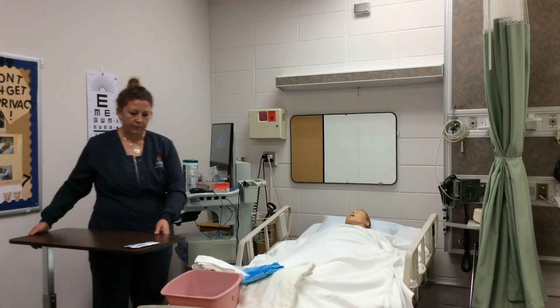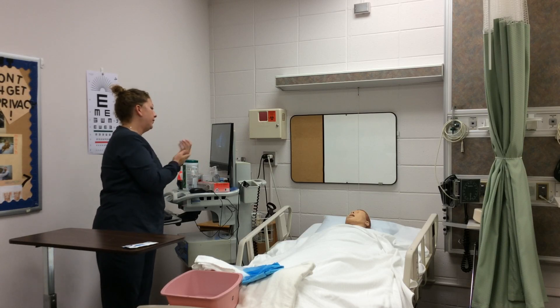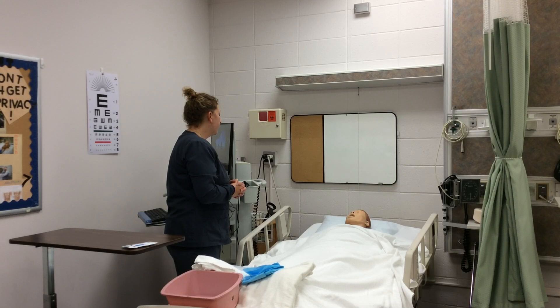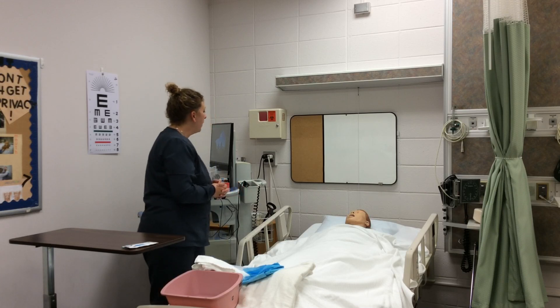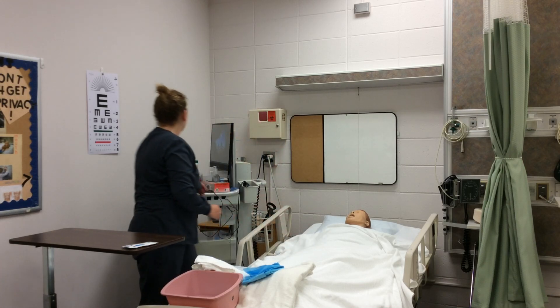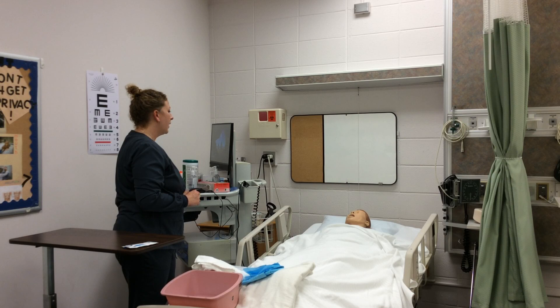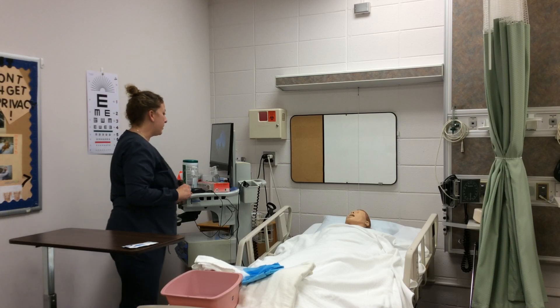Provide patient privacy and perform hand hygiene. She pulls the curtain and closes the door for privacy. She introduces herself: 'I'm Sarah and I'm a student nurse.' She identifies the patient using two identifiers — name and date of birth — comparing these with the patient's identification bracelet and medical record. She checks for allergies by asking the patient and comparing to the medical record, confirming no allergies will affect the procedure.